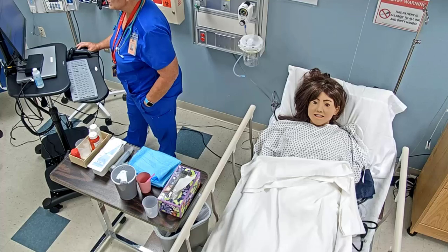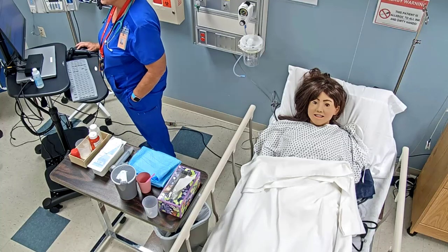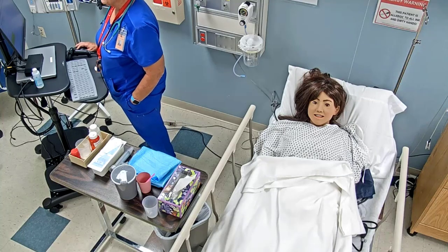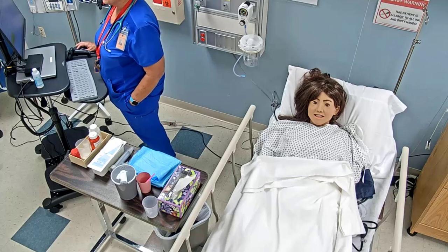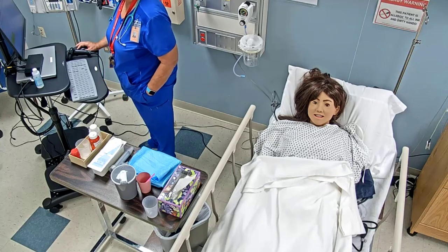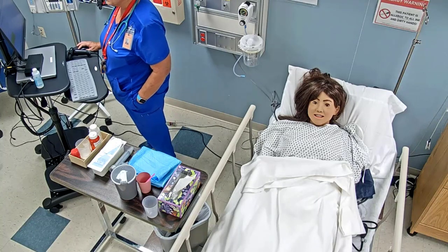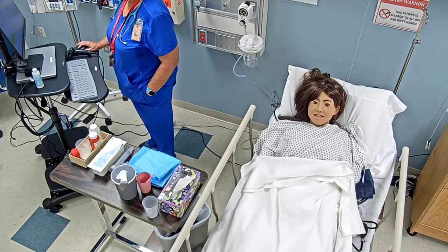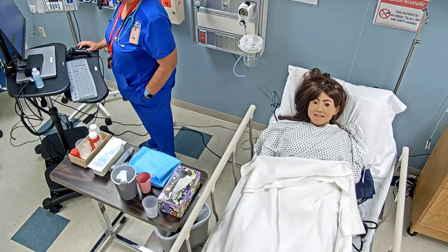I have Pepcid 20 milligrams oral suspension daily per peg tube. I'm going to go to my MAR. I have Anna Taylor, date of birth 4/24/1991, no known drug allergies. And I have Pepcid 20 milligrams oral suspension daily per peg tube. And this is going to be my 9 o'clock dose. So I'll go back to my orders.